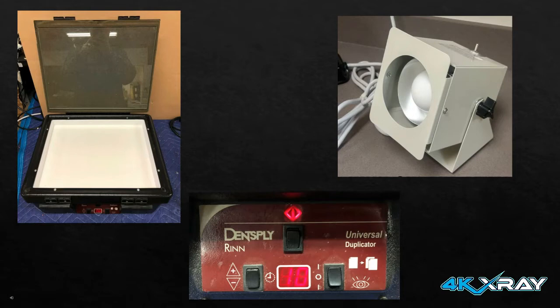However, many techs think there was not a way to make an image darker. Using an old film X-ray duplicator, which you can see here on the left, if you were to take a low exposed, underexposed image and place it on the X-ray duplicator, you can actually change the density and make the image appear darker. It was not ideal. It was not great for patient care and for diagnosing an image, but it was great for needle placement in the OR.